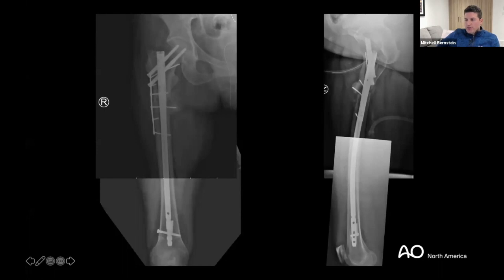A really, really good question. Okay. So the question is, in the 90-year-old patient where you used a reconstruction type nail as opposed to the geriatric nail, aren't you more concerned about implant cutout with the reconstruction nail? And I think Ed Westrick alluded to this, but if Jeff, you want to chime in on that comment. I think it's a very, very good question.